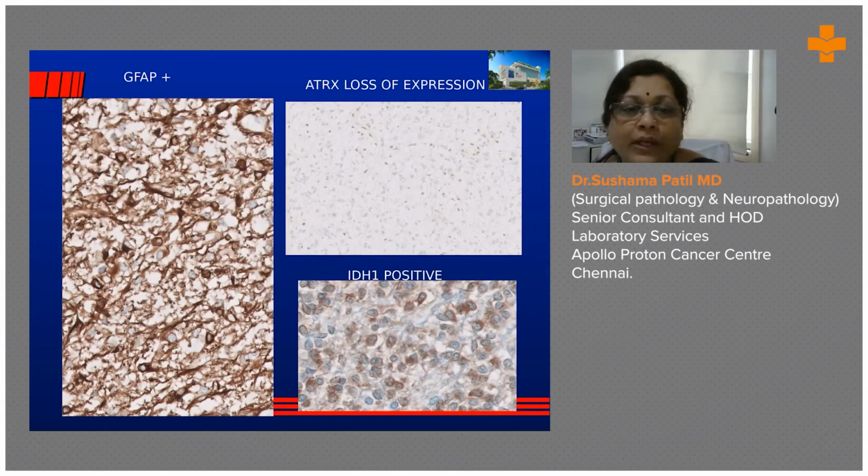Okay, so usually they are positive for glial fibrillary acidic protein. This is the basic, because the tumor cells produce this GFAP protein, which we can use for highlighting. Okay, on the left hand panel, it is a GFAP, glial fibrillary acidic protein, and the tumor cells in the center, many of them you are seeing, the nuclei is blue, and around it you see the brown structure, that is the brown color, that is the positive cell. Cytoplasm is positive.